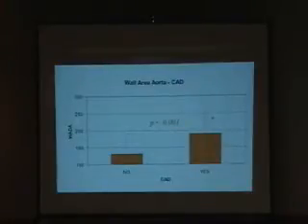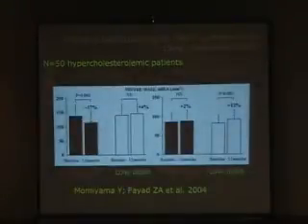And we are doing currently analysis on stroke patient, diabetic patient, etc. So you can imagine the kind of result. And it's not surprising why we're finding this, because we are measuring the disease itself. We're measuring the plaque that we're seeing. And other things that you can do is obviously putting this in the setting of lipid lowering or any kind of intervention, because this is what you want to do. You want to do some kind of intervention.